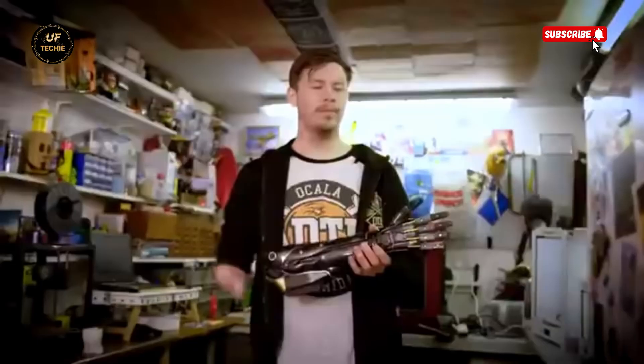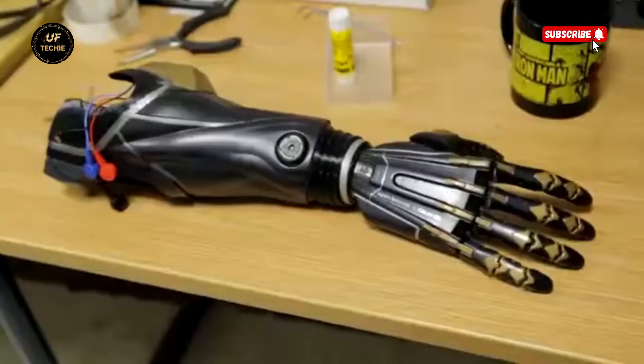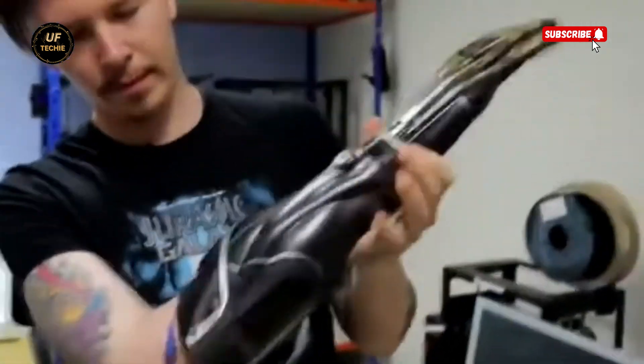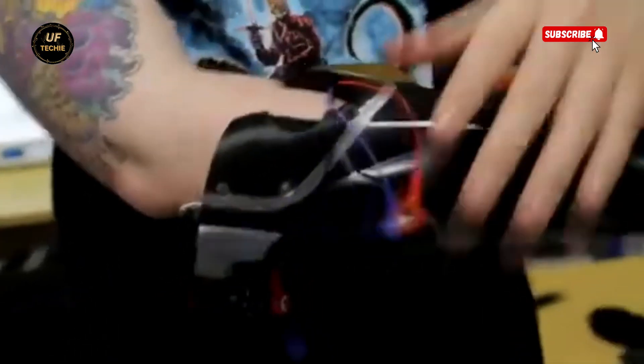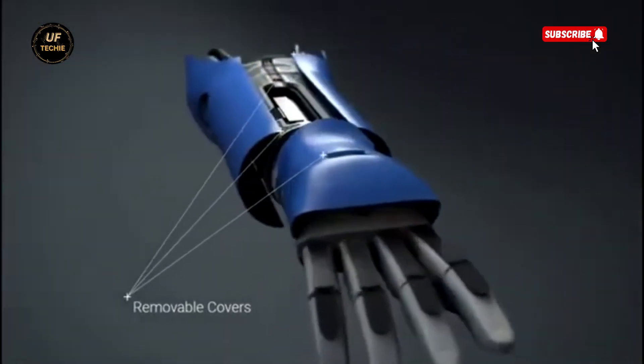The Hero Arm responds to the smallest muscle movements. Intuitive myoelectric sensors detect signals from the residual limb's muscles, allowing the user to control the arm with remarkable precision. Want to open your hand? Pick up a glass? Or press a button? Just flex your muscles, and the arm responds.